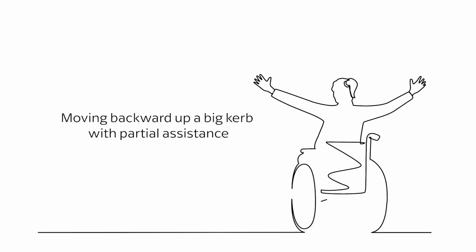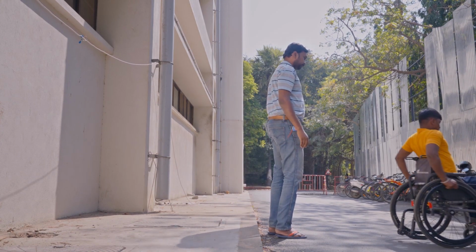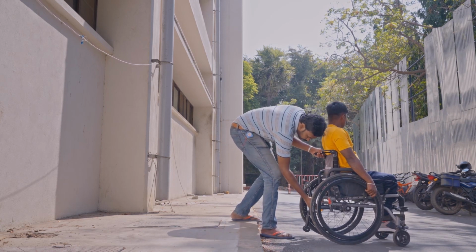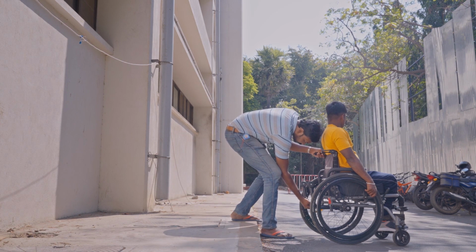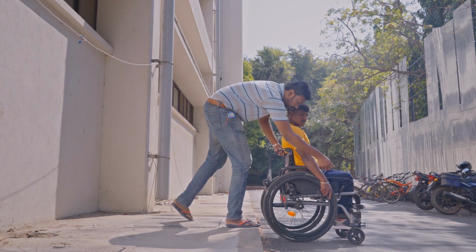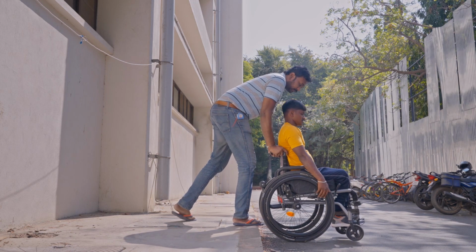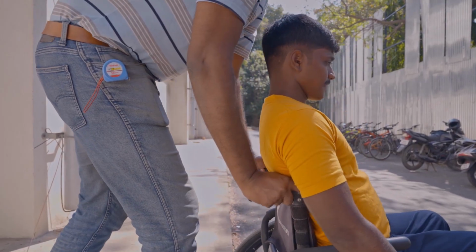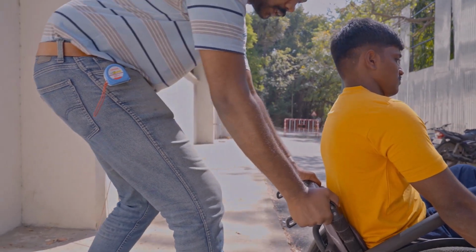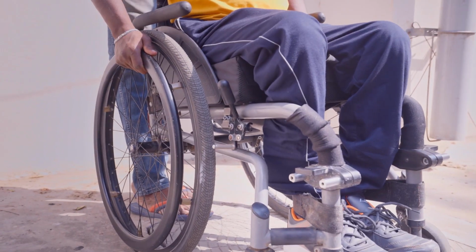Moving backward up a big kerb with partial assistance. To move up a big kerb backwards with partial assistance, begin with your back facing the kerb and an assistant standing behind you. Pull the wheelchair backwards. When the rear wheels touch the edge of the kerb, the assistant should pop the casters, and you rest your back on the backrest. Now as the assistant slightly tilts the wheelchair back in wheelie position, on count of 3 at knee level, pull the wheelchair backwards and up with a sudden force to climb the kerb.